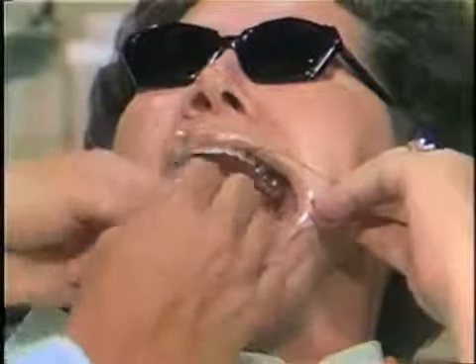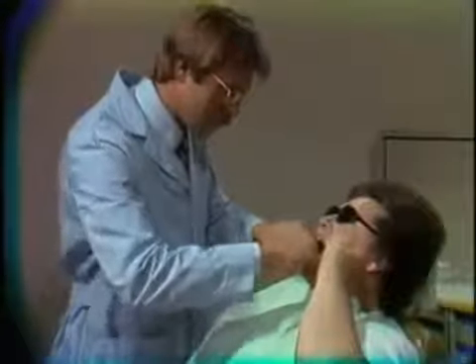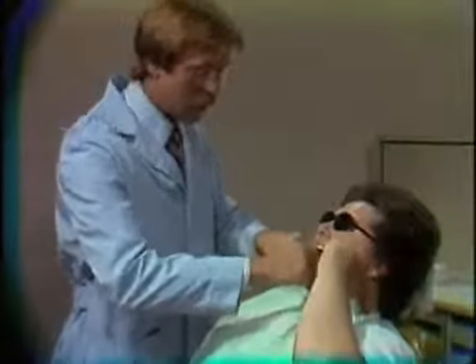Okay, we're going to take it then to the patient's mouth, and we're going to ask the patient to place that in your mouth. Yeah. And for better visibility, we'll seat the appliance, to get started correctly. There, and find the correct path of insertion. Make sure the cheek is out of the way.